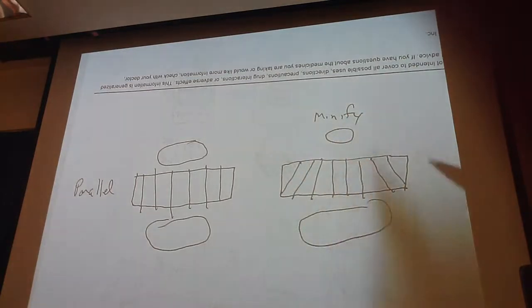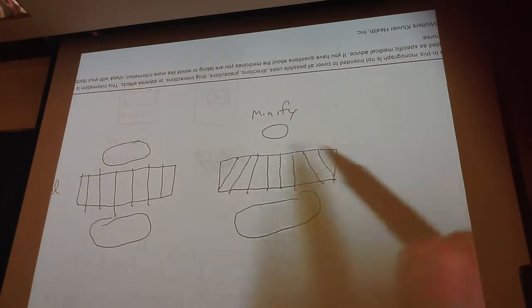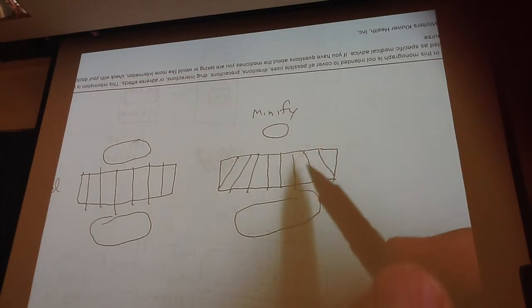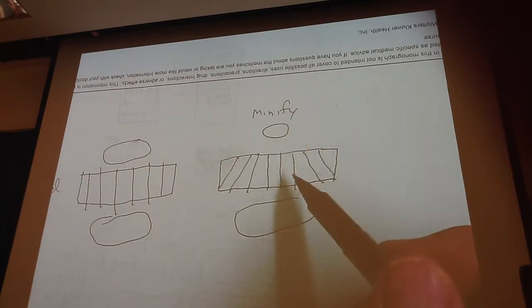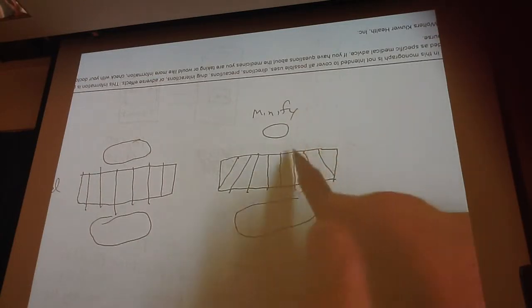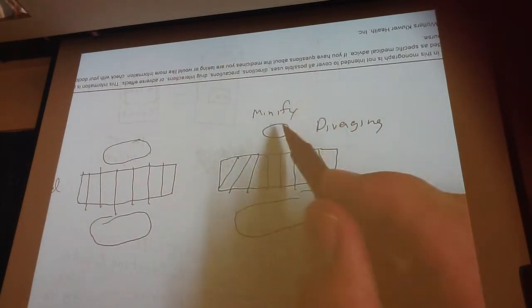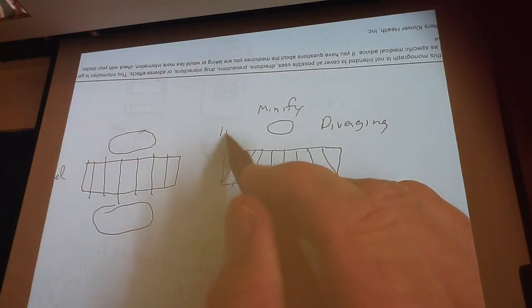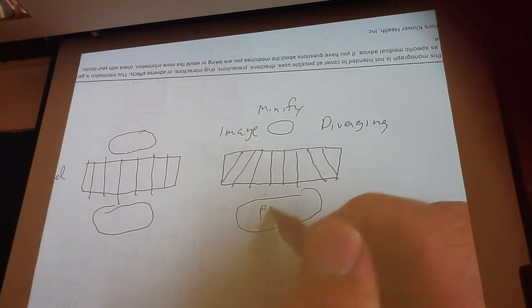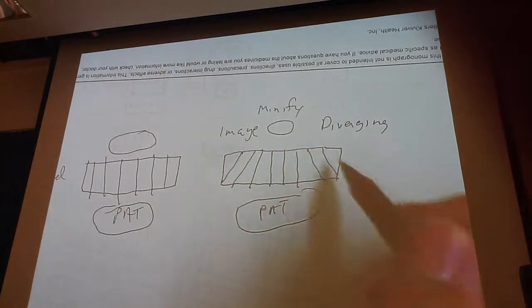Mainly you'll see these on portable cameras because they only have like a 9-inch thing that, if you were doing a lung scan with a parallel hole collimator and a 9-inch diameter camera, you would have to do the right upper lung, the right mid lung, right lower lung, and you'd have to do the left upper, mid, and lower. You'd have to do like a ton of pictures. But if you put on a diverging, so diverging means that, this is the image up here. So this is your crystal, and then here's your patient. So diverging means that it's going outward in relation to the crystal, so it minifies things.